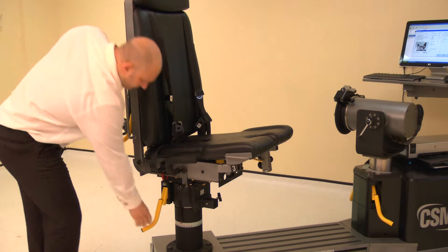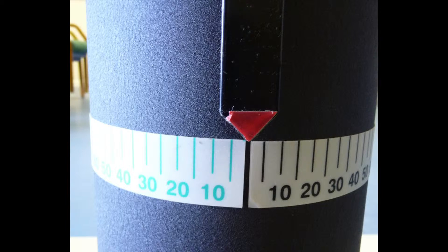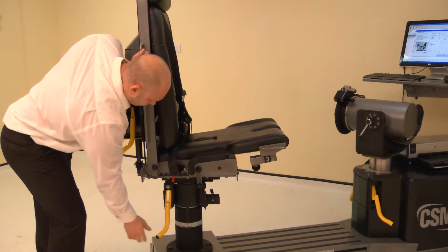Now adjust the chair rotation. Lift the locking handle and rotate the chair to 0 degrees on the black scale. Ensure both locking handles are pushed down to secure.